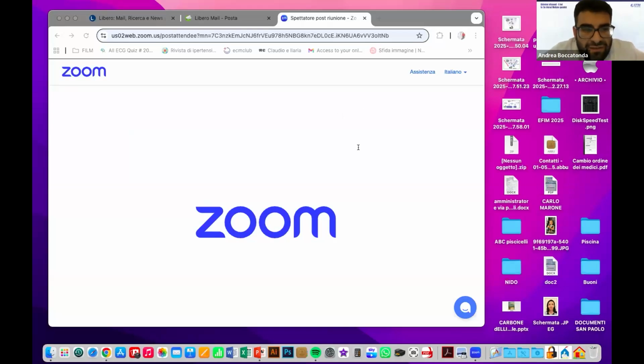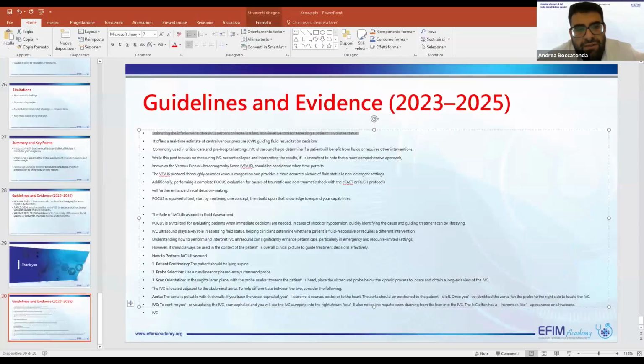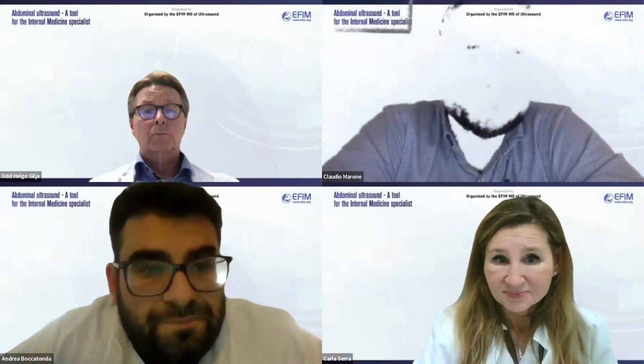This is one of the most relevant applications of contrast ultrasound in internal medicine and emergency medicine. In particular, on B-mode ultrasound we can observe, in most severe cases, cortical areas of hyperechoic or even hypoechoic modifications, but the real game changer is surely contrast ultrasound, in which we can detect hypoperfused areas, especially in the portal and late phase of the exam.